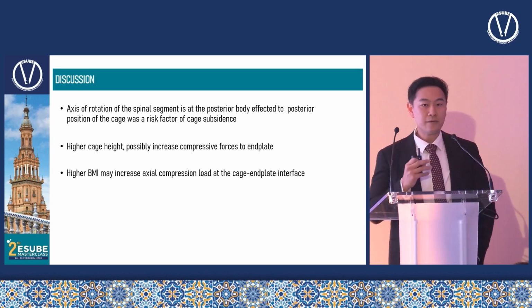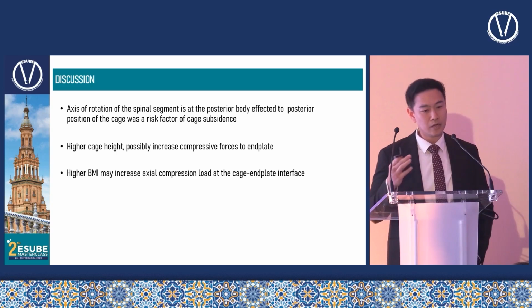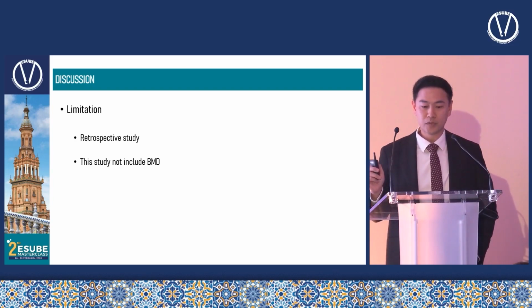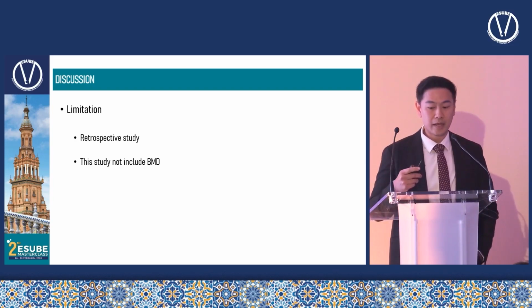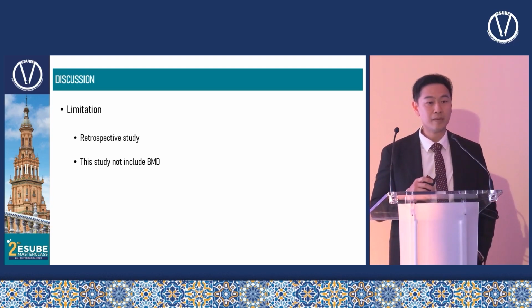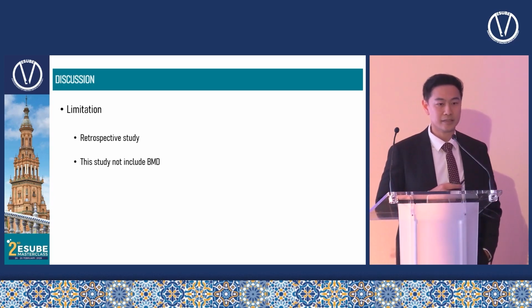If the BMI is more than 25, I always discuss with my patient the risk of subsidence. The limitation of this research is that it is only a retrospective study, and this study did not include BMD. I think BMD may be a strong risk factor for cage subsidence.